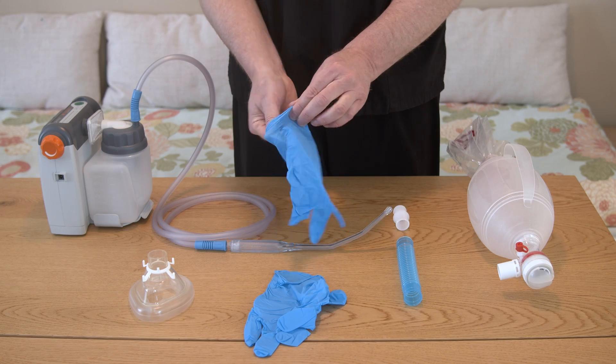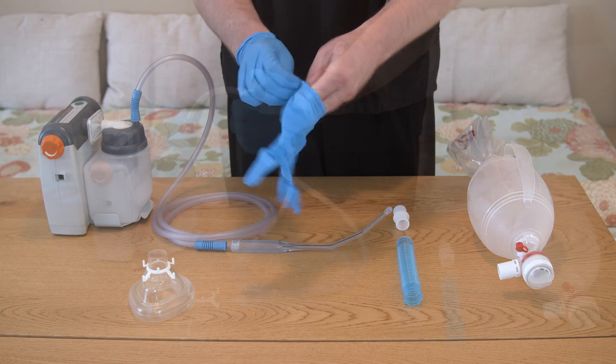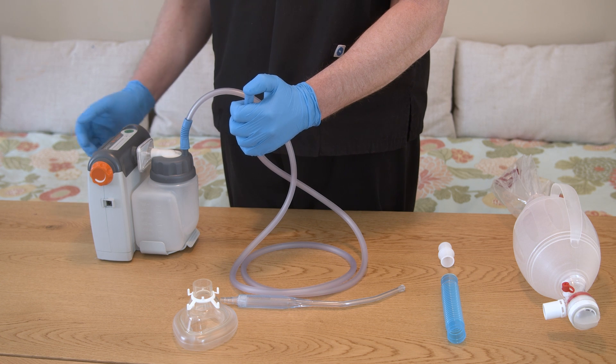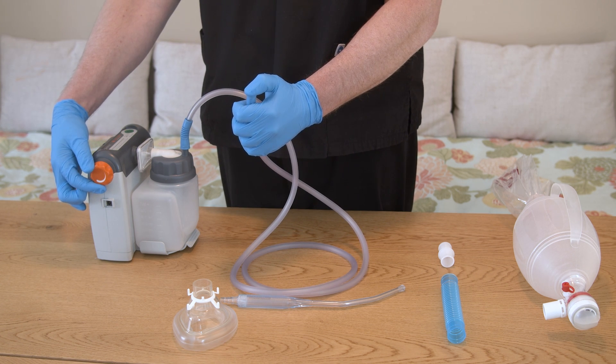Put on the non-sterile gloves if you want to wear gloves. Gloves are not required for this treatment. Check to make sure suction supplies are prepared and ready for use, and that the machine is working properly.